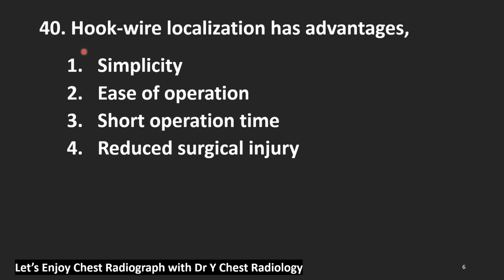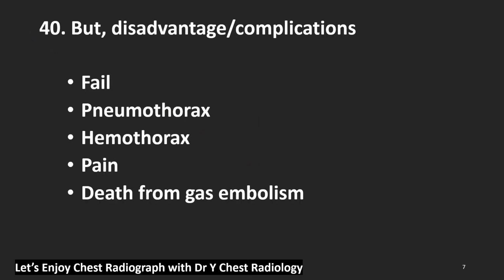It is known and studied that hook wire localization has some advantages. One is its simplicity. 2. Ease of operation. 3. Short operation time. 4. Reduced surgical injury. But regrettably, there are some disadvantages or complications of this hook wire localization method.